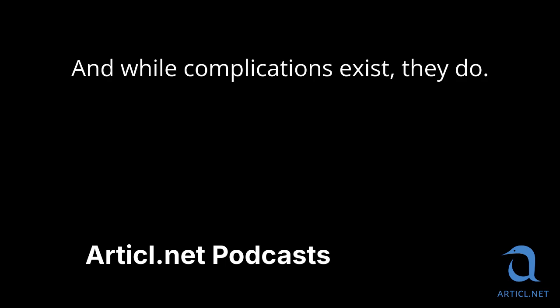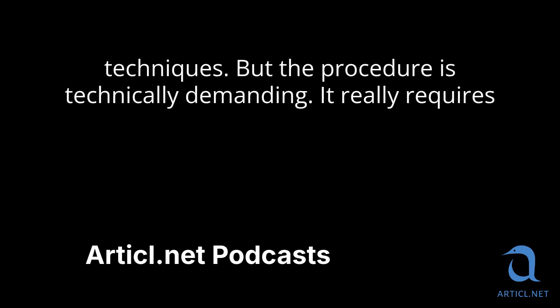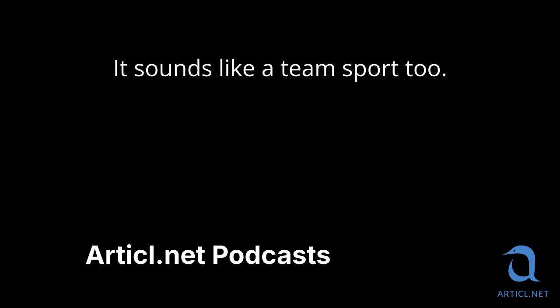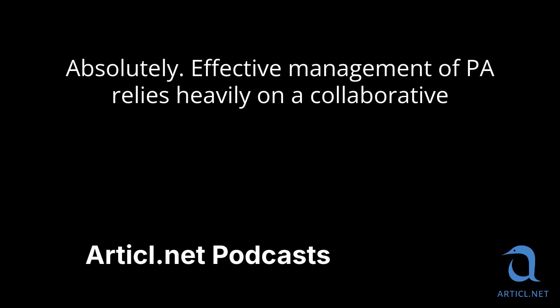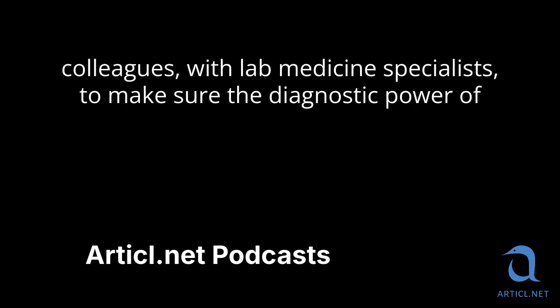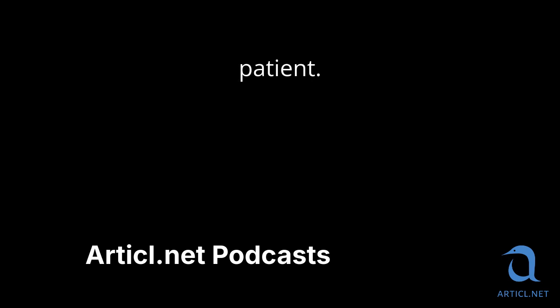And while complications exist. They do, but things like adrenal hemorrhage are thankfully rare now with modern techniques. But the procedure is technically demanding. It really requires highly skilled, experienced interventional radiologists, ideally working in specialized high-volume centers. It sounds like a team sport too. Absolutely. Effective management of PA relies heavily on a collaborative, multidisciplinary approach. We need to work closely with our endocrinology colleagues, with lab medicine specialists, to make sure the diagnostic power of AVS is fully translated into the most effective, targeted therapies for each patient.